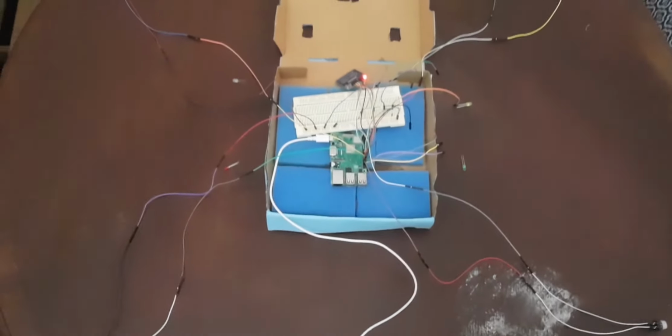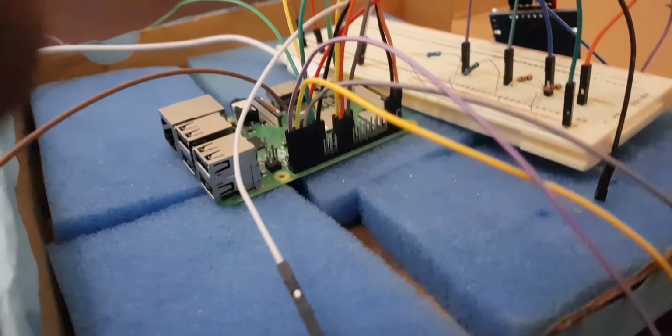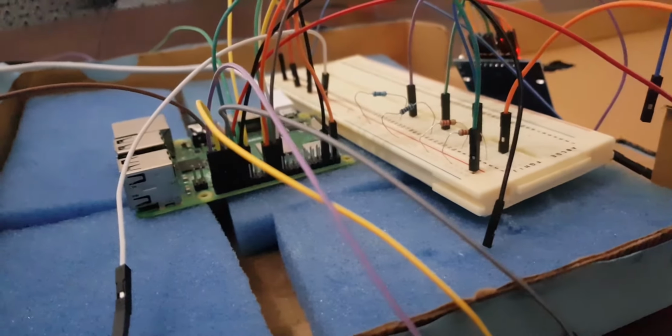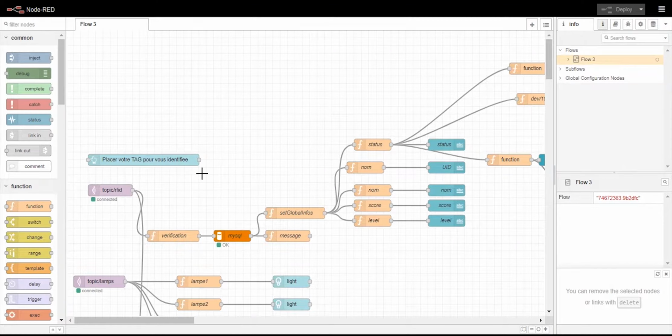Basically, the components are buttons for light manipulation, distanced by 1 meter from each other. Here we have the Raspberry Pi connected to our RFID card scanner. Of course, we have the LEDs controlled by the Raspberry Pi GPIO outputs and connected to the breadboard with the resistance. Node-RED is a flow-based development tool for wiring together hardware devices, APIs, and online services as part of the Internet of Things. Node-RED provides us with a flow.